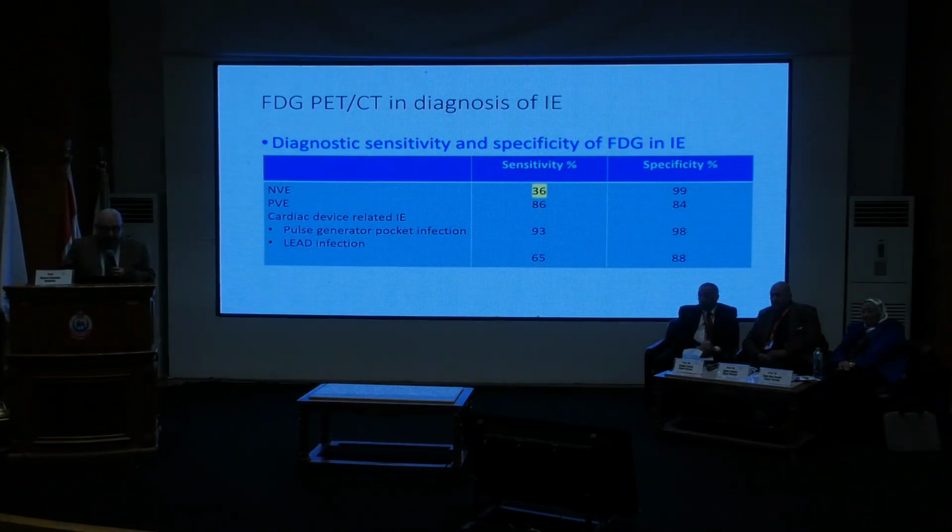It has very good sensitivity and specificity for prosthetic valve endocarditis, but it has a low sensitivity for native valve endocarditis. Meanwhile, it has a very good specificity in detection of infective endocarditis in native valve endocarditis. So it is a very good positive test in native valve endocarditis, but it's not a good negative test. It's a good negative in prosthetic valve endocarditis, but not in native valve endocarditis.